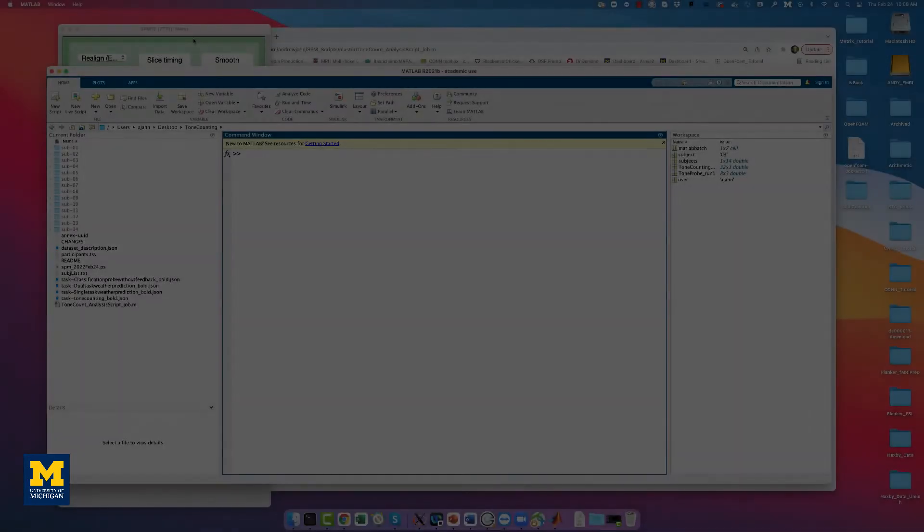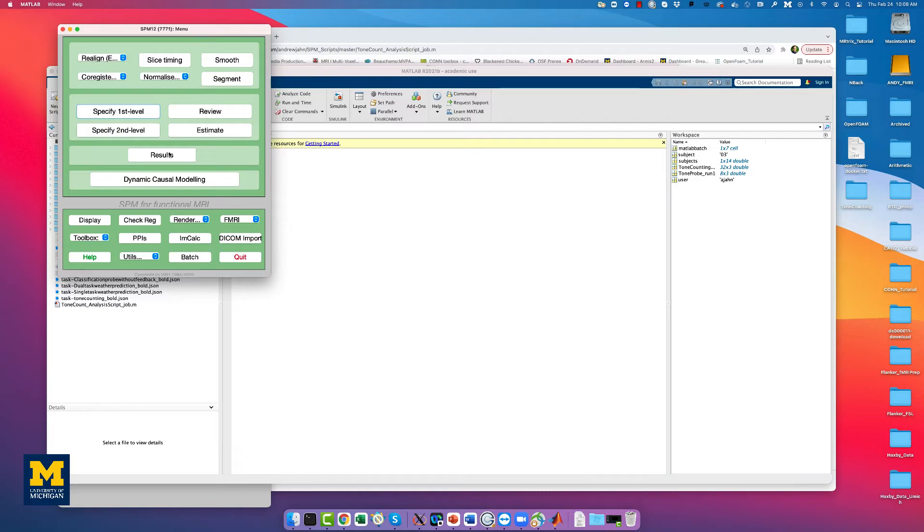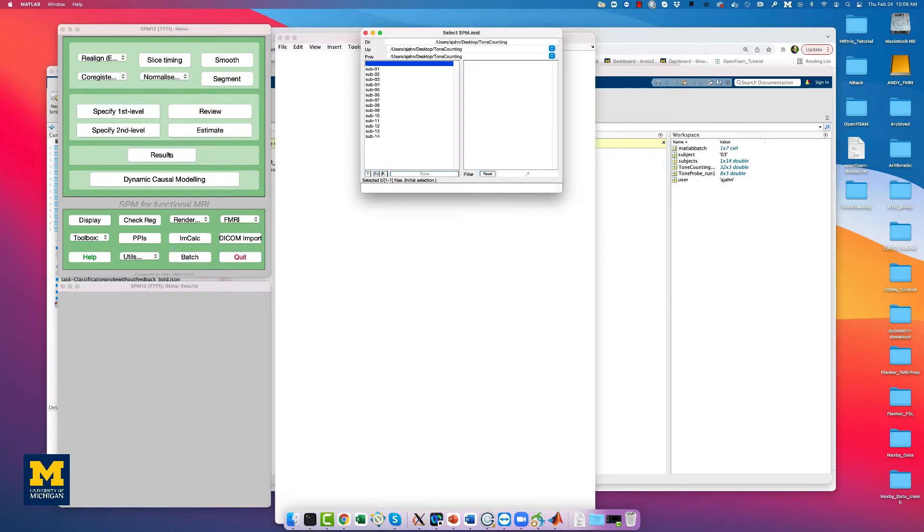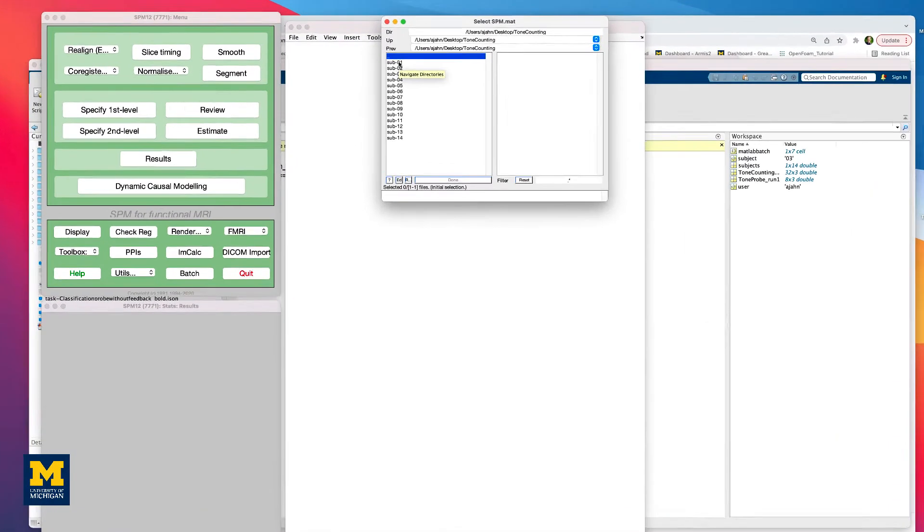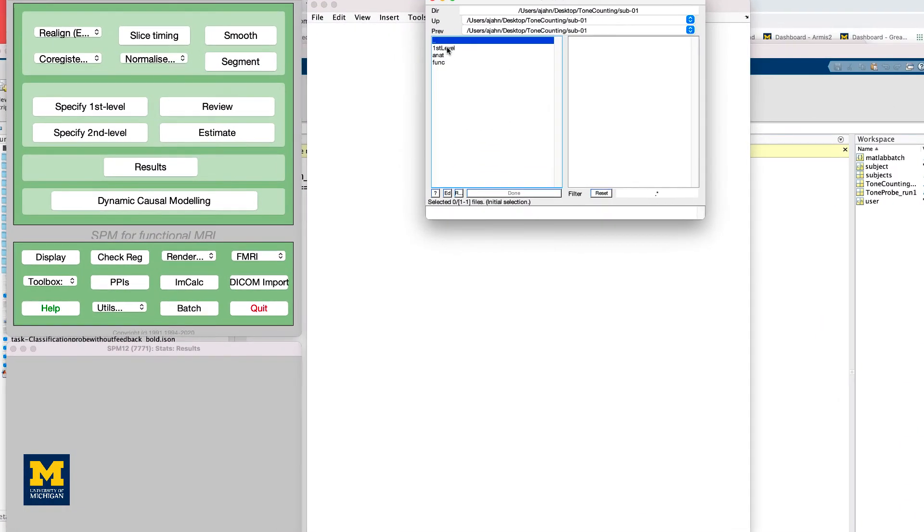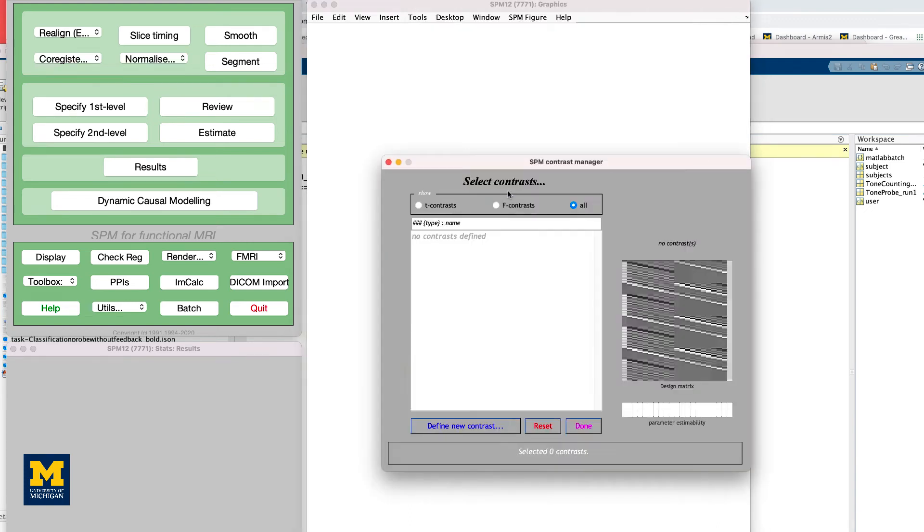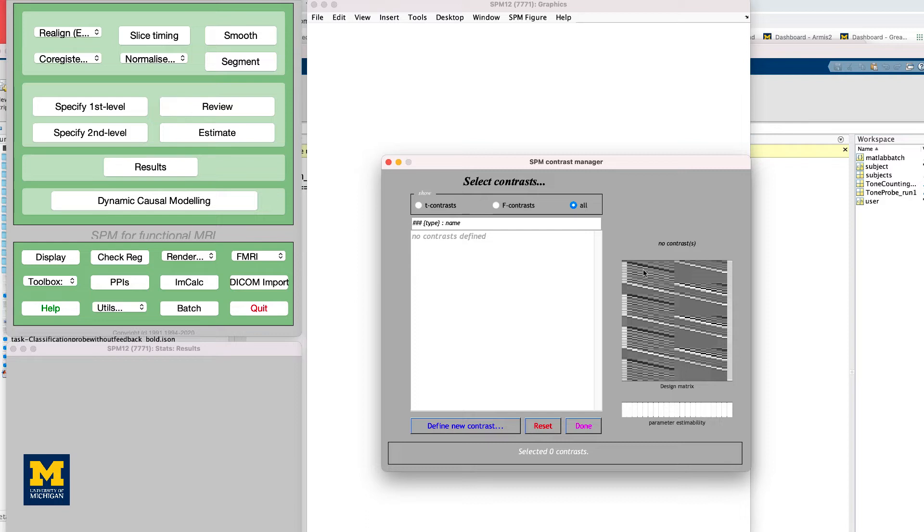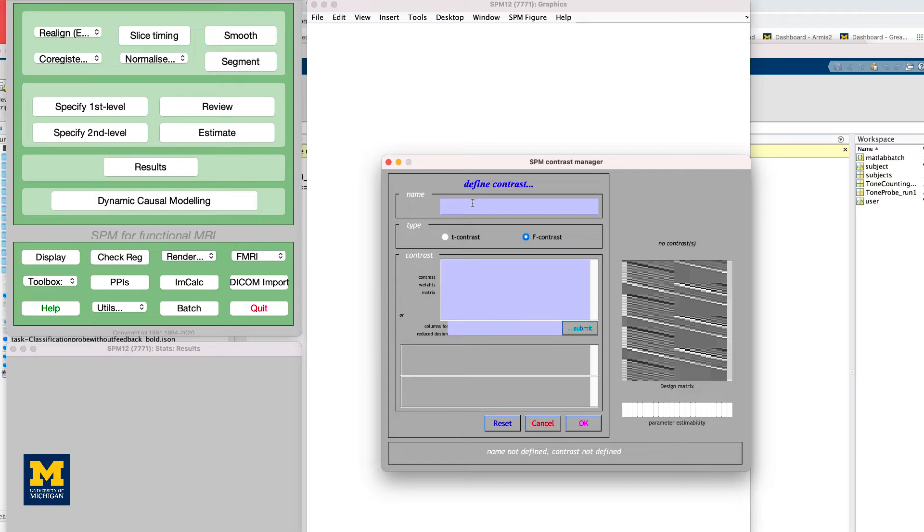To view the results, click on the Results button and select the SPM.mat file within the directory Sub01 First Level. This will show the design matrix with 10 finite impulse response regressors per subject, per condition. If we wanted to see where there was any event-related response to any of the time points that we estimated, we could calculate an F-test. In other words, conduct multiple t-tests, one per regressor, and see whether any one of them is significant.